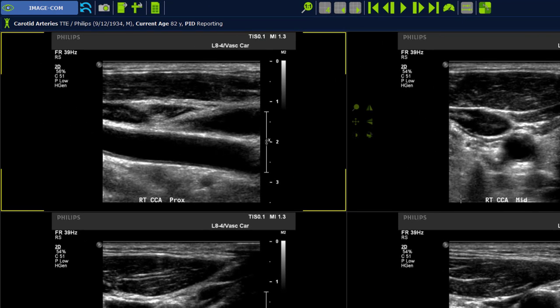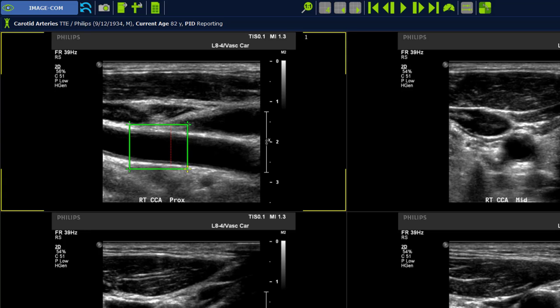In the next step a measurement window has to be drawn with two left clicks. The red line defines the minimum size of the box.